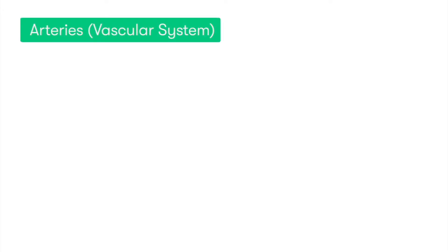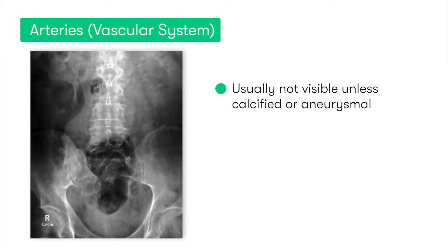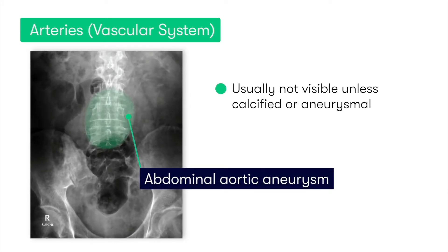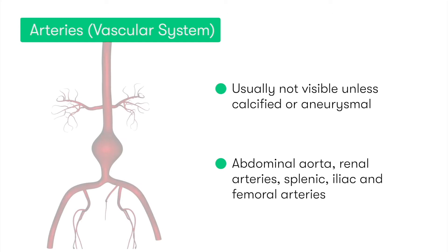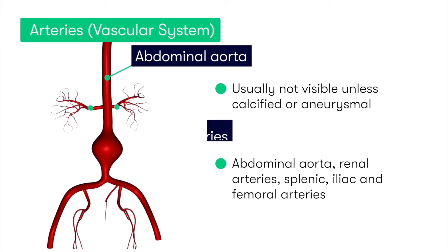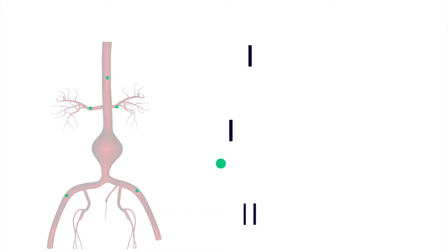Starting with A for arteries: normally we shouldn't be able to see any abdominal arteries or the aorta, so when we can, it's usually because their walls are heavily calcified or the arteries may be aneurysmal. The main vessels to look for are the abdominal aorta, the renal arteries, and the splenic, iliac, and femoral arteries.